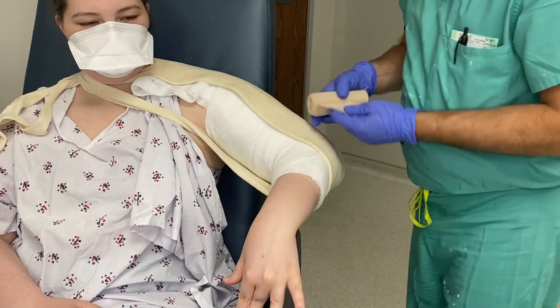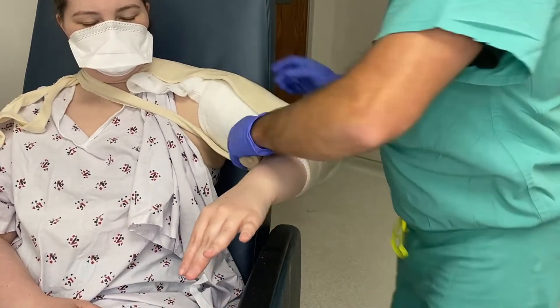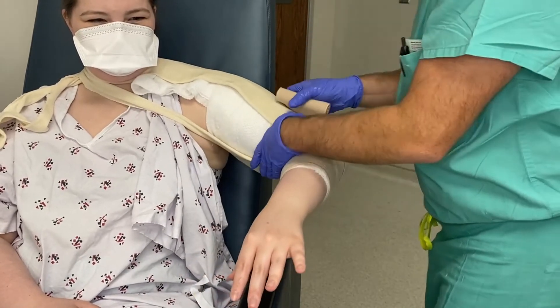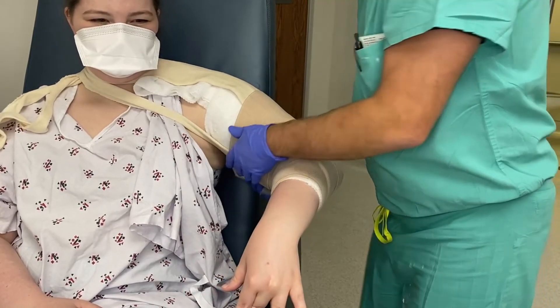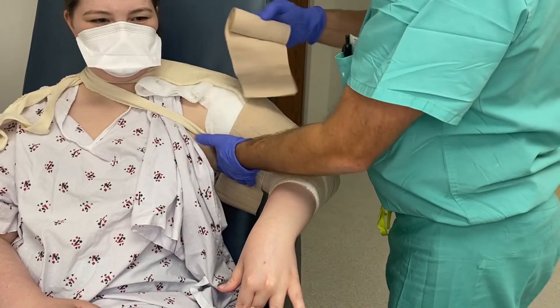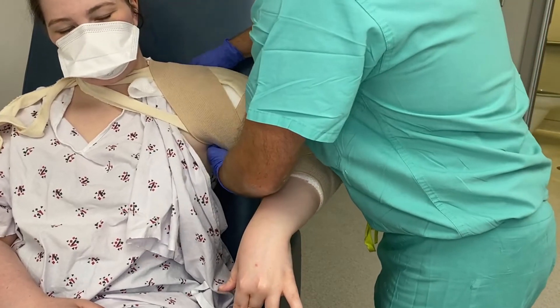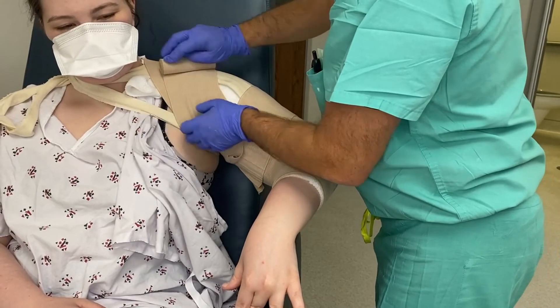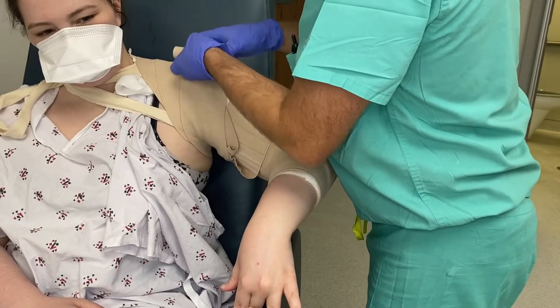Next, apply the ace wraps. 50-50 overlay. When I get to the top, I'll go up high and then come back down around the armpit and just build down 50-50 from there. If it slides down, don't worry about it because once we cut these straps off, we will adjust as needed.